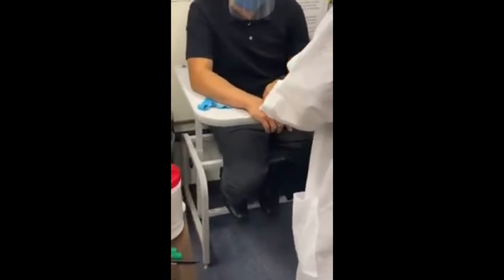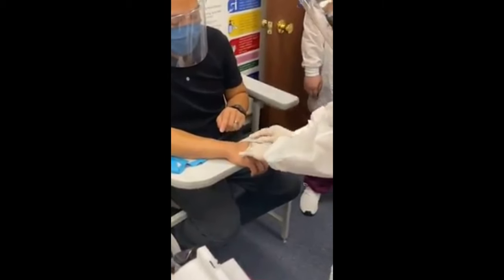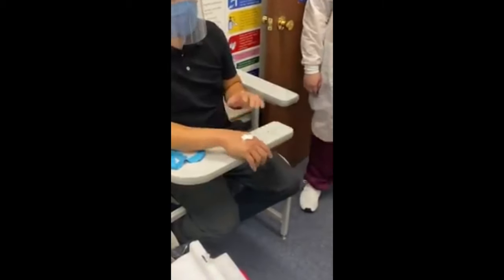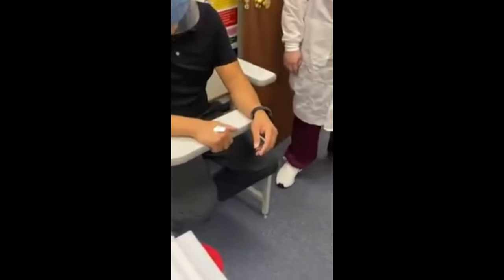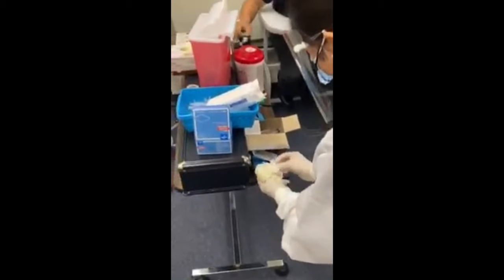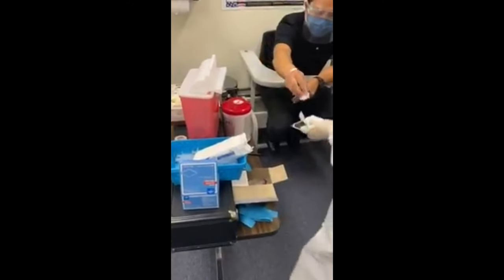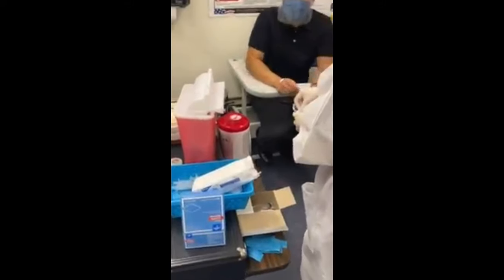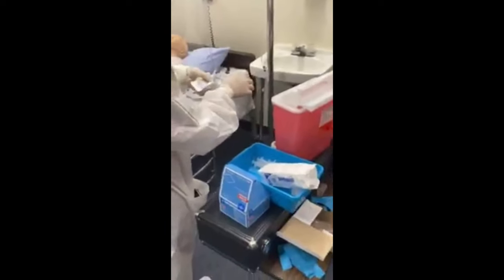So I'm just going to bandage you. Okay, perfect. You already have the tape prepped, good. And then you're good to go, thank you. Good to go, and then you can just let the patient leave. Okay, and then you just clean up. For the tourniquet, we'll just save the tourniquet. And then you just throw away the rest. Actually, go ahead and toss everything, and then how you would redo it, just go through the motions. So ball everything up in your glove, throw it away, and then do the last part.